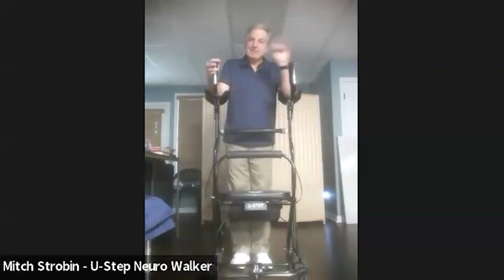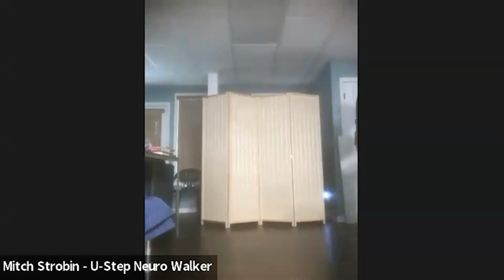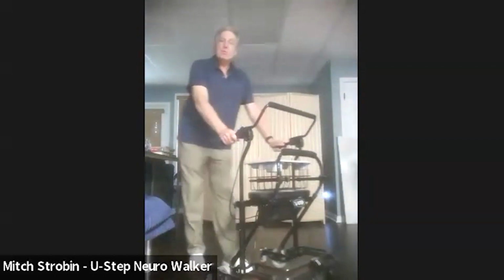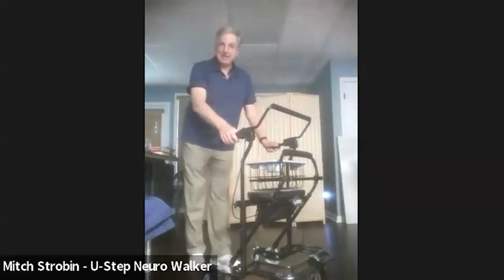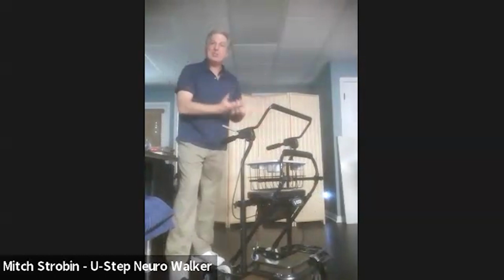But wait, there's one more U-Step. It's like a game show. There's always another, right? We got to have a third one. So let's go get it. Now this third U-Step is typically for individuals with what we call weak hand strength, okay? It's called the press down U-Step.